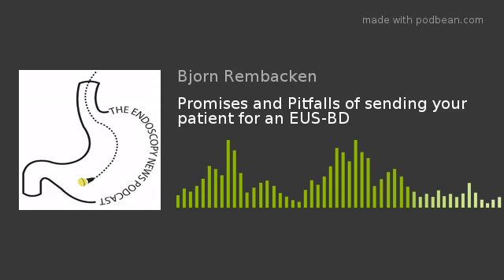So generally, our rule of thumb is that the minimum size of bile duct that we will tackle is 12 millimetres. We have gone down to about 10 millimetres, but the risk does go up considerably in those patients that your bile duct stent will not open up and deploy in the correct space, and that you will have a stent that opens up in the duodenum rather than in the bile duct. And certainly, if you're starting this practice, I would not go for any bile ducts that are less than 14 millimetres to start off with.